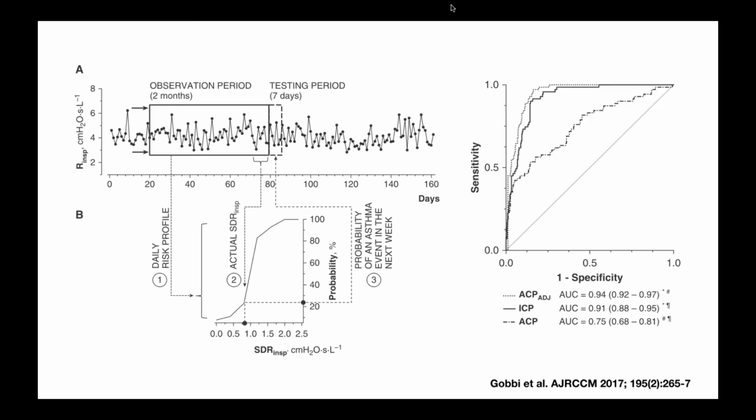The funny looking graph below is a graph of risk, or a conditional probability. The graph matches the risk of high spikes in resistance, i.e. airway narrowing, in relation to the nature of the variability during a given time.